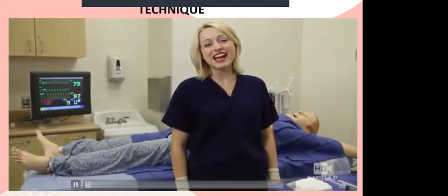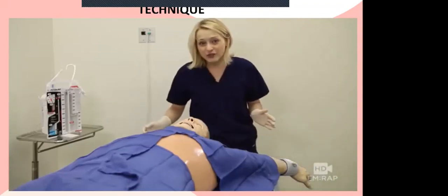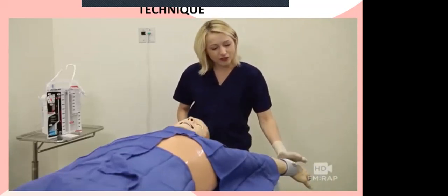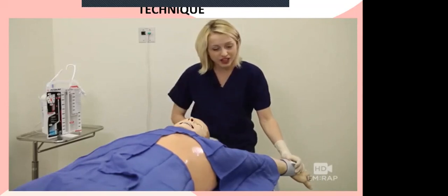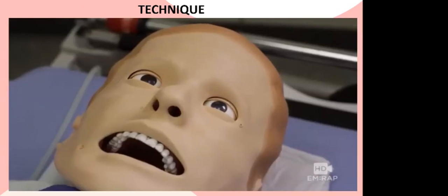I'm Dr. Jess Mason, and this is a method for chest tube placement. Before you get started, make sure your patient's pain is well controlled and secure their arm up behind their head with tape or a restraint. I want to make sure this guy doesn't move.